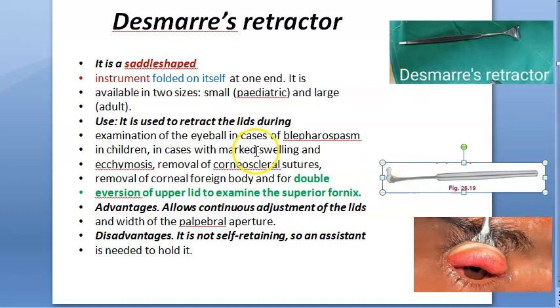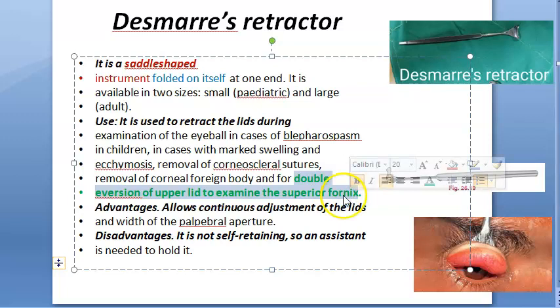To summarize: this is a saddle-shaped instrument. The key thing to remember is double eversion of the eyelid to examine the superior fornix. You're retracting the eyelid during examination of the eyeball. You can examine the palpebral conjunctiva, check the superior fornix — all of that. This is Desmar's retractor, a saddle-shaped instrument of ophthalmology.